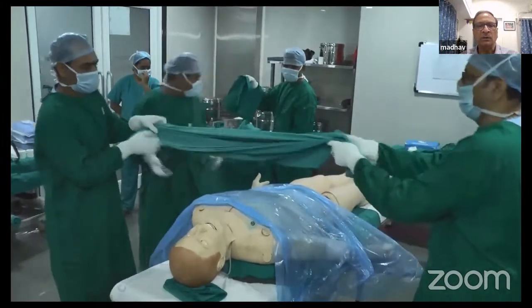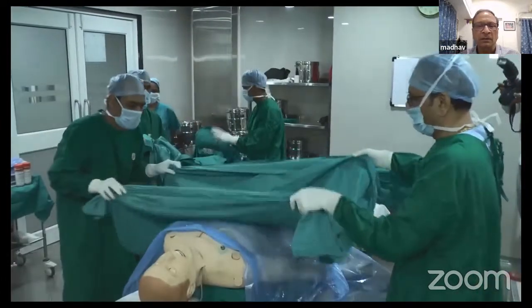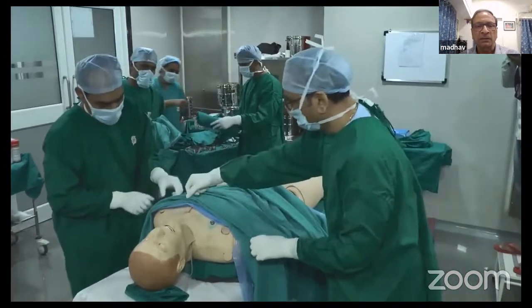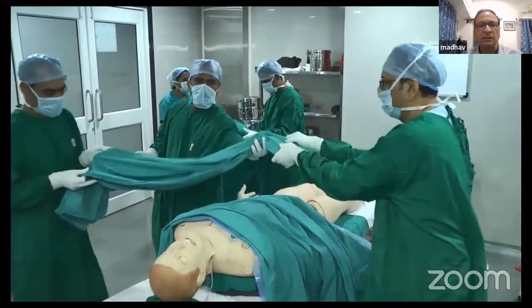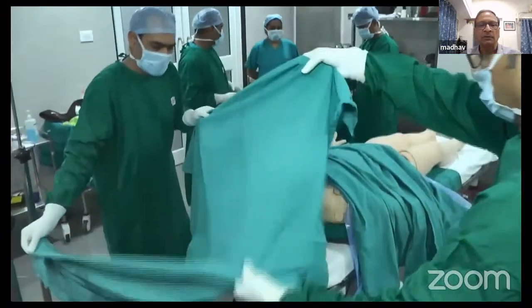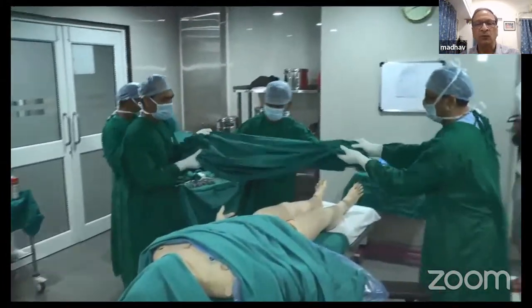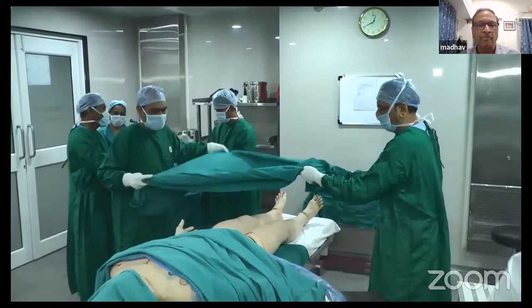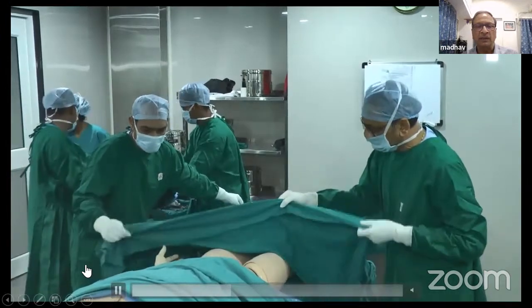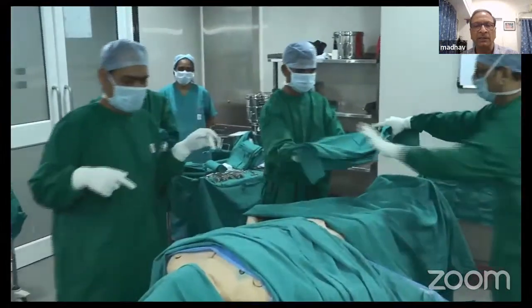This is now covered with a cloth drape, which will go from the edge of the plastic to the pelvic area. Now, the second sheet comes from the head end, fold the edge onto itself, and just let it fall at the level of the chin. The big sheet here is now covering the lower half of the body, the legs.